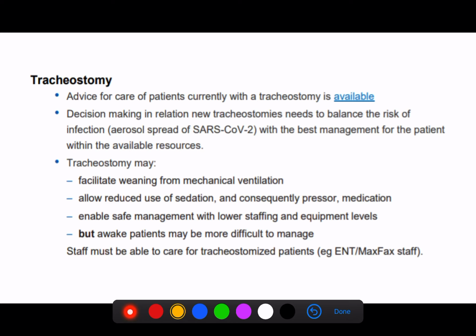But certainly I'm finding that a lot of these patients are requiring prolonged ventilator weans. A lot of them, especially the biphasic patients who initially present with an L phenotype and then progress after a few weeks into an H phenotype, do seem to fail extubation quite a lot, and so tracheostomy may be the best way to try and wean them off mechanical ventilation.